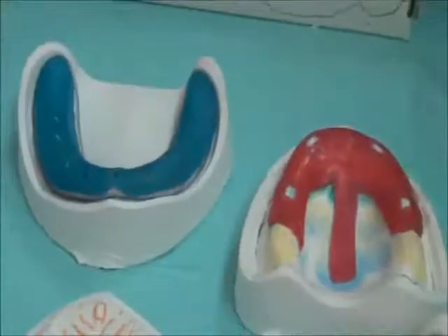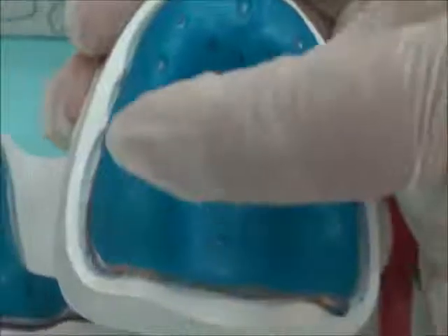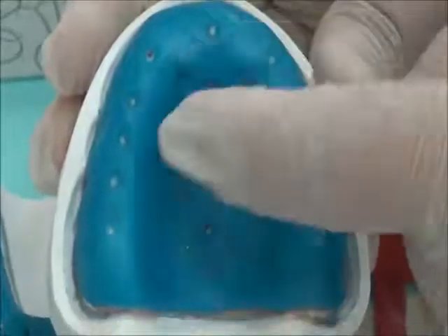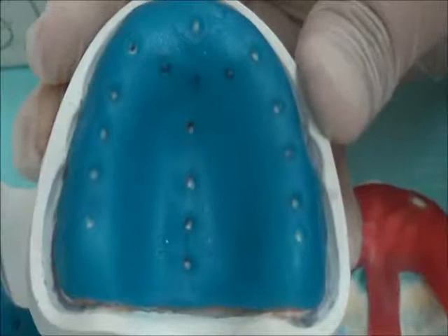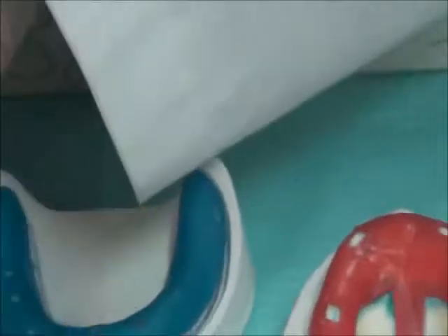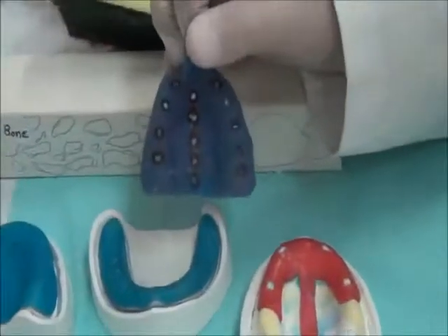On the upper, we place the holes in the following areas. Once more, on the areas we need to relieve, which are in front of the tuberosities, over the crest of the ridge, over the incisive papilla, the rugae area, and the mid-palatine suture area, just before placing the handle. Once we place the handle, we will have the following situation with holes inside, and impression material is free to escape from these relief areas.